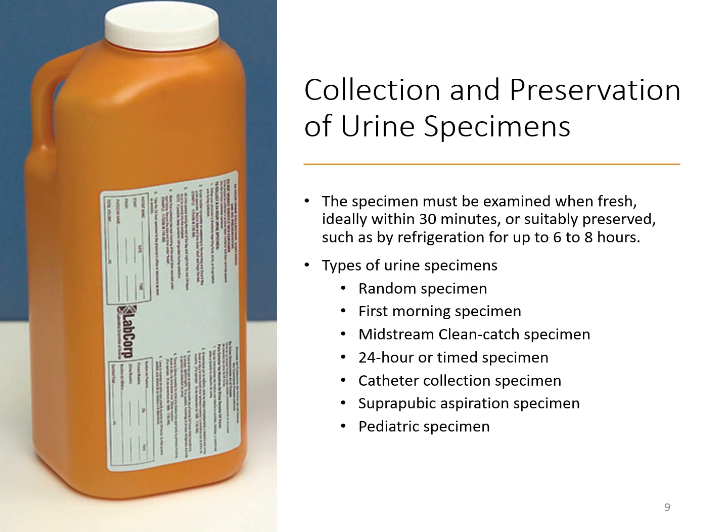Because infants can't urinate on command, they usually have a bag attached to the child, and whenever they urinate it would collect in the bag, and then the bag is taken off, and that specimen would be examined.